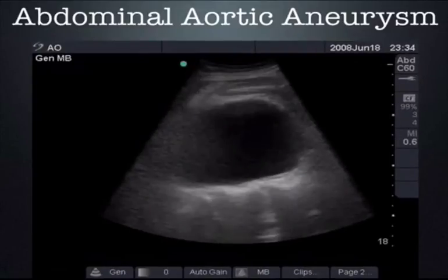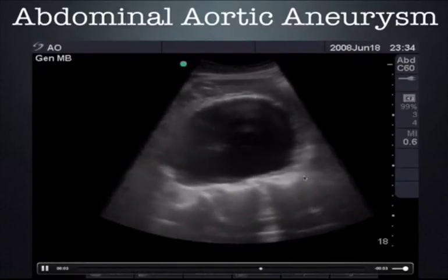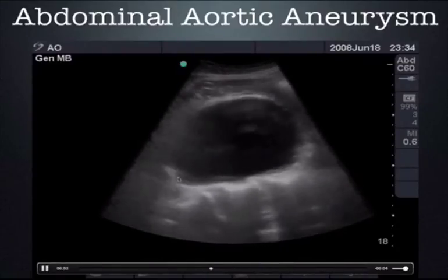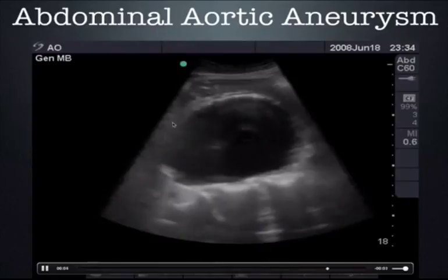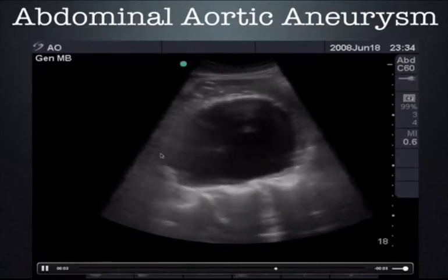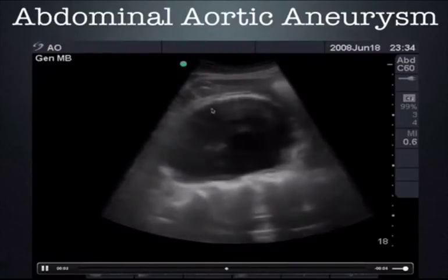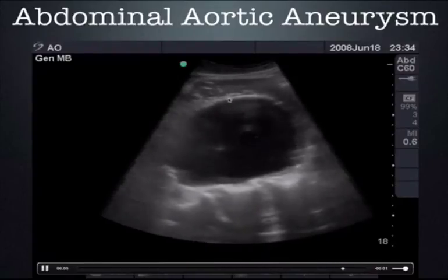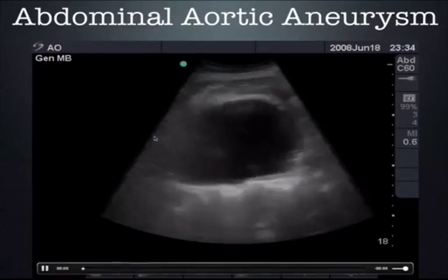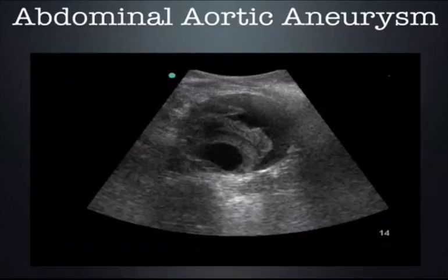Now this is the same abdominal aortic aneurysm. They've turned the long axis here, and you can see the spine here. And here is the aortic aneurysm, a nice fusiform aneurysm, and you can see that it tapers on either side, and the normal segments of the aorta are hidden in the bowel gas. So again, this illustrates quite nicely that the most anterior portion of the aortic aneurysm is only 2 to 3 centimeters of depth and is quite visible despite the fact there is a lot of bowel gas around this aortic aneurysm.